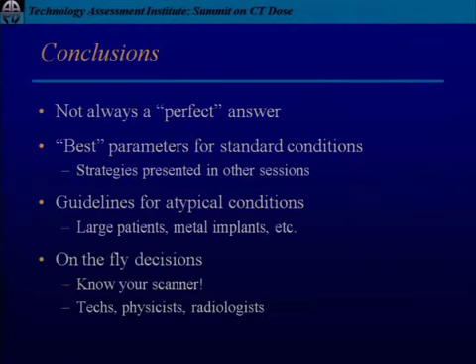Also, there will inevitably be moments where somebody has to make a decision on the fly, where something presents itself and you just can't do it with what you have. My advice for this is know your scanner, know the functions, know the capabilities, know what it can do. And this isn't advice just for the physicists. This is really for the technologists, the physicists, and the radiologists. Everybody has a stake in this. Everybody has their own unique perspectives, experience, and expertise, and everybody can contribute to making the scanner work as best as it possibly can. Thank you.